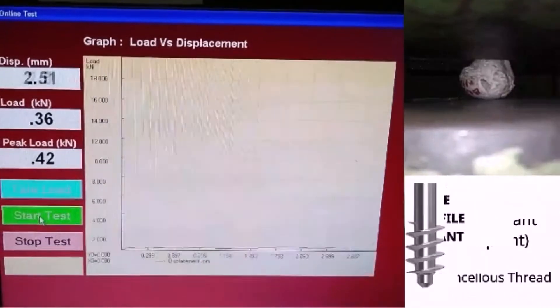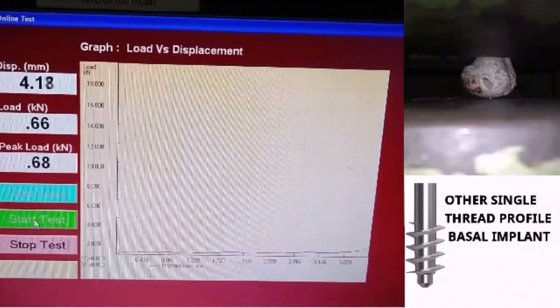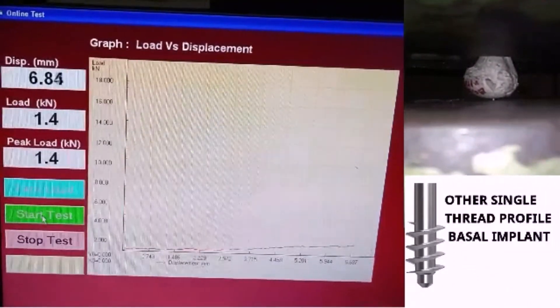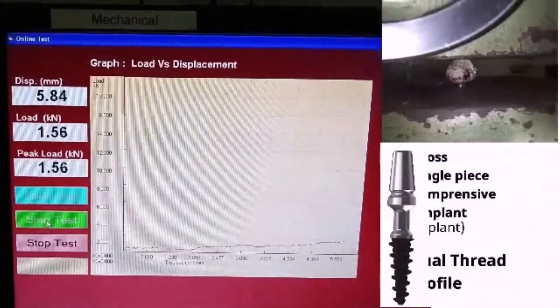Other company's single thread profile basal implant. Peak load: 1.6 kilonewton.